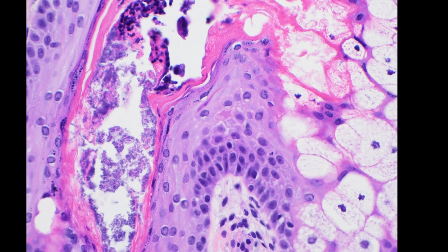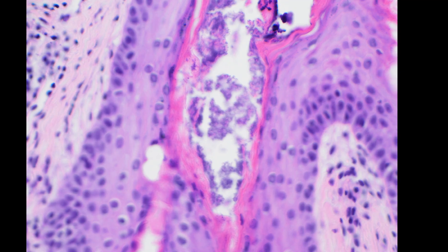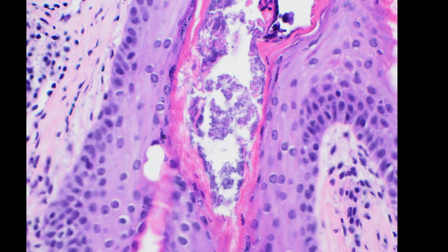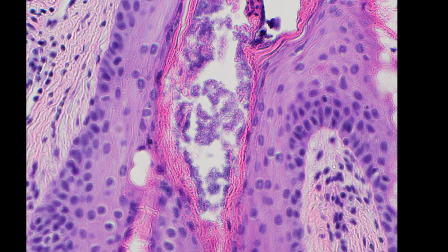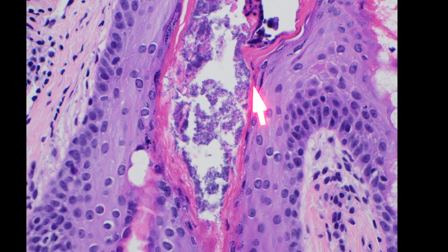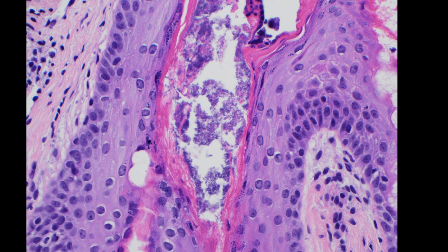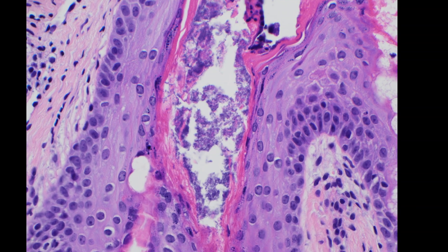Down here in the inflamed hair follicle, there's some blue, grungy, speckled material. And if we go really close — this is the closest I can go on my microscope, but if you use an oil lens, you can see it a little better. These little blue things are tiny, blue, round dots. They're very, very small, and it is hard to get them to show up on this screen. So these are bacteria — all this blue stuff in here. There are thousands of little bacteria in here, in the lumen, right next to this crunched-up neutrophil debris.